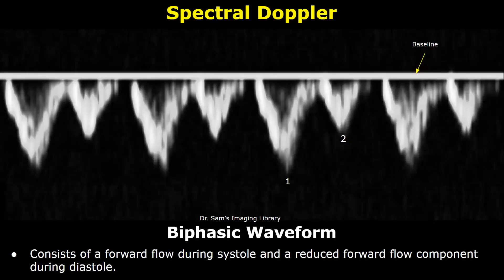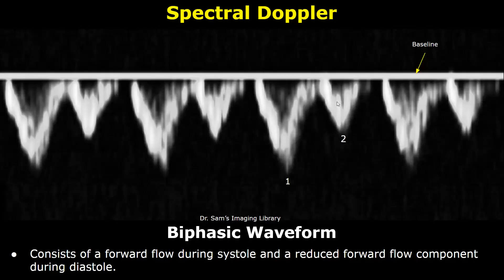Usually in veins we find flow below the baseline because the blood is moving away from the probe. This waveform is from a hepatic vein, so you may find the waveforms being below the baseline due to the direction of the blood with respect to the ultrasound probe. This is also considered a biphasic waveform because we see two prominent components — one is a sharp systolic peak and the other one is forward diastolic flow. These types of waveforms can be a bit tricky in deciding whether they are biphasic or not, but if we see two prominent but different components, you can consider it a biphasic waveform.